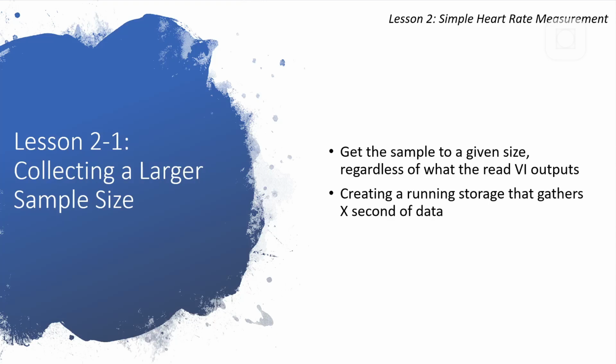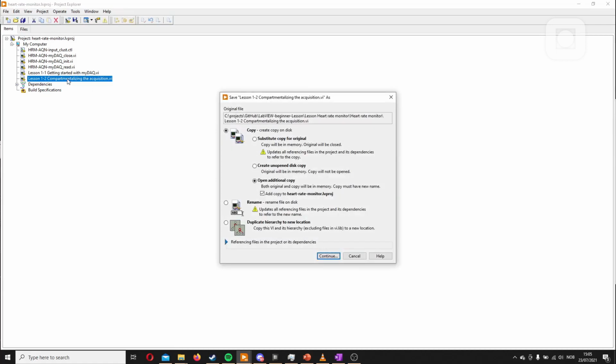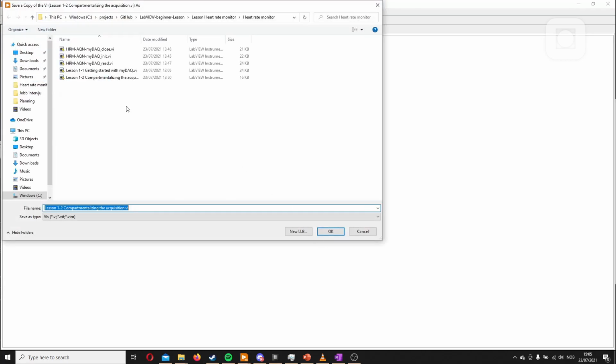This is because we want to filter and analyze the data later. It's much easier if you can control the sample size. We'll be creating something that stores the last X amount of data, where X is configurable by us. We can start by just making a copy of this. You could just use this lesson here, but for simplicity's sake, I'll just copy it.